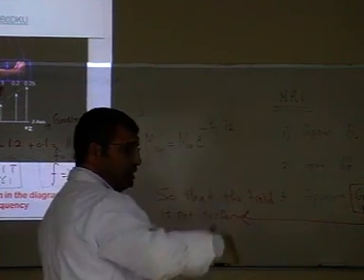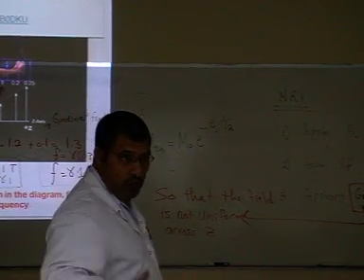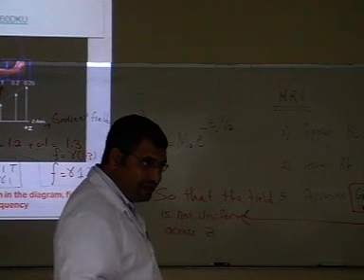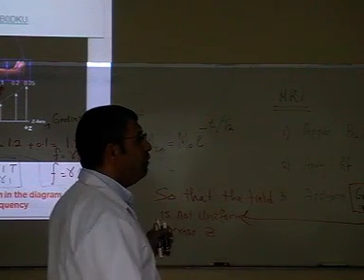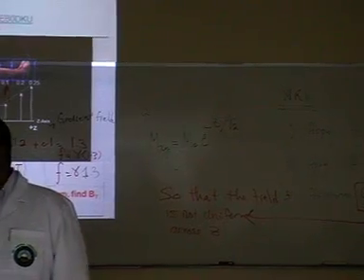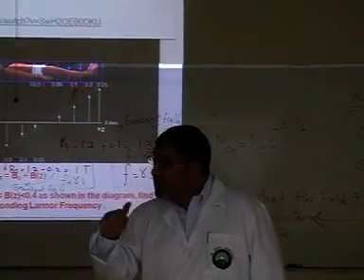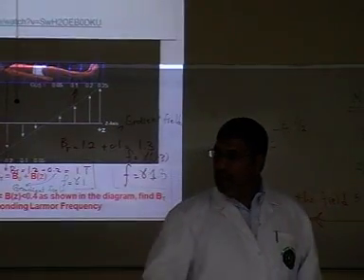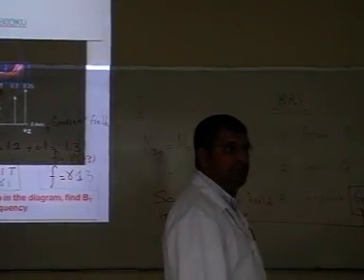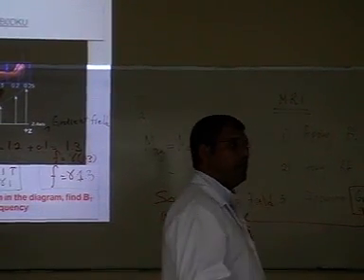So instead of looking at the whole z-axis as one uniform magnetic field, every part of the z, by the way, they call it spatial gradient field. Do you know the word spatial? What is the word spatial? Position. Spatial, not special, from space. So spatial means with position. So this is a spatial gradient field. That means every position as you go across, it's different.